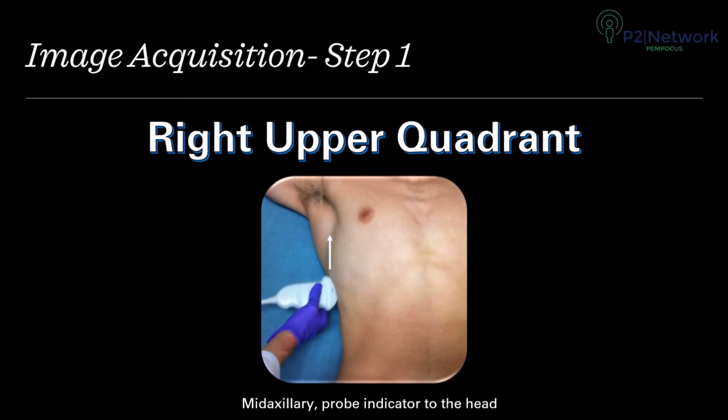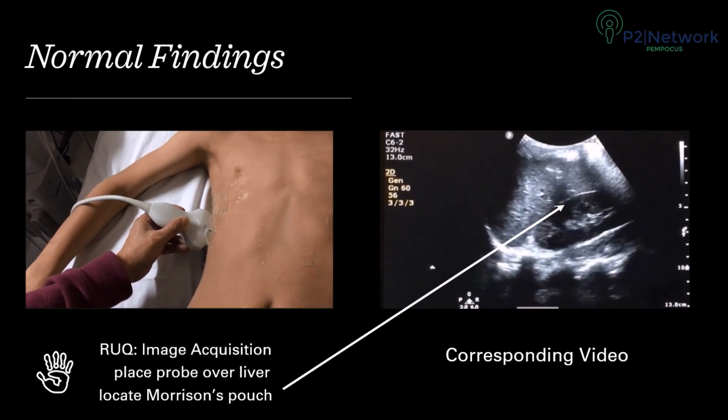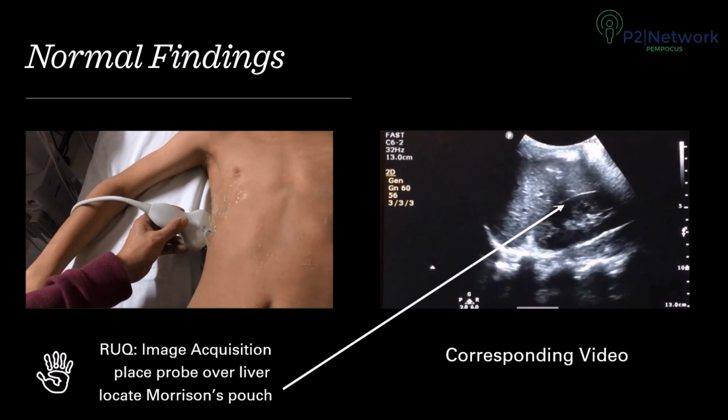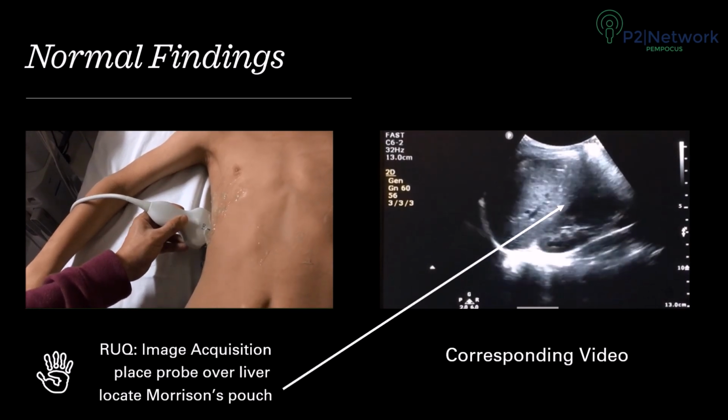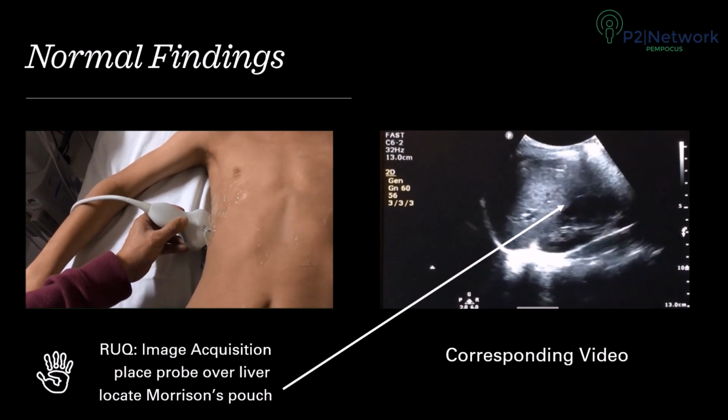The exam starts typically in the right upper quadrant at the mid-axillary line with the probe marker pointing towards the head. Fan through Morrison's pouch, which is the region between the liver and the right kidney, shown in the video here.